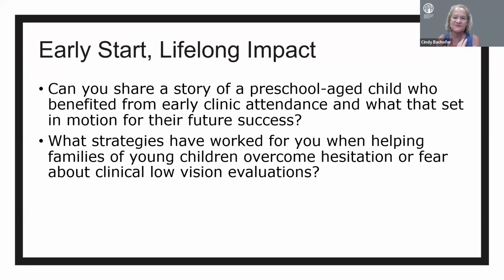And I think it helps families to talk about it if they have that reluctance, that uncertainty about their child having to use a tool that is different from all their peers. Let's talk more generally about tools. How do all of us use tools that help us out? Making sure that the parent has looked through the telescope and knows how it works.